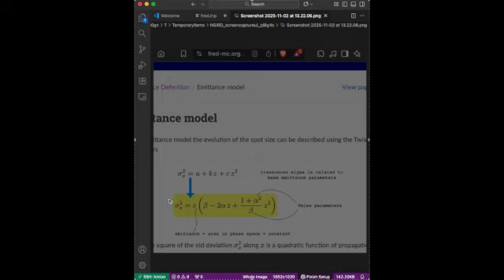And twiss parameters. So sigma squared, this is how the standard deviation, I would say, of the beam. Like if you have, how does it deviate from the center, from the mean energy, from the mean beam, that is given by this emittance, which is in the shape of an ellipse. Of course, it's an area.